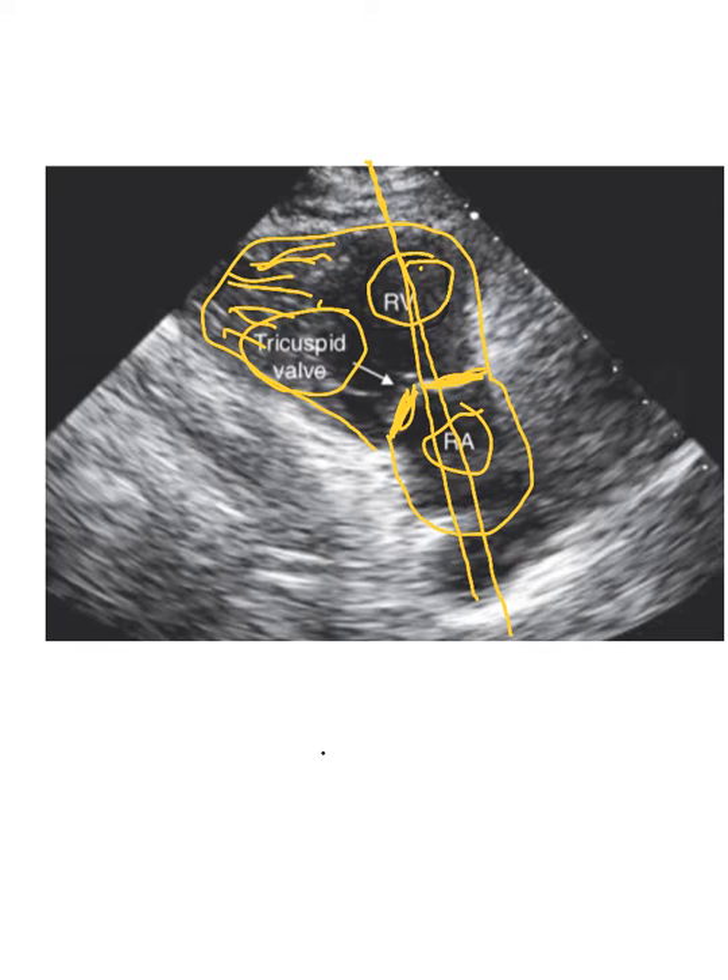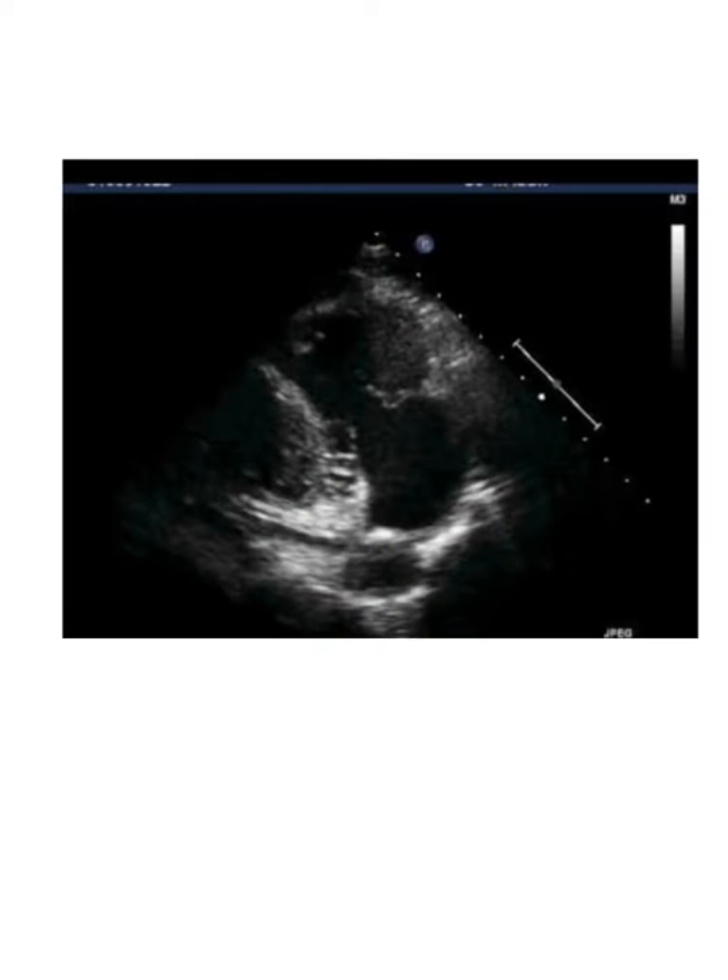This is not going to be a long video because there's not a lot to show, but I've got a couple more pictures. Okay, here's another view — same kind of concept. We've got the RA down here, the tricuspid valve, and the RV up here. This is the interventricular septum — it's actually the bottom, or more mid-range, of the interventricular septum. You can see it there, that's why I pointed it out.